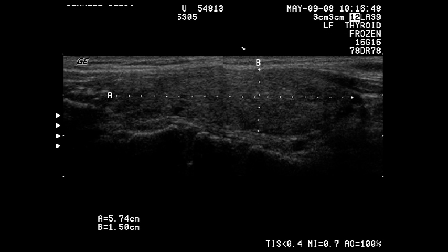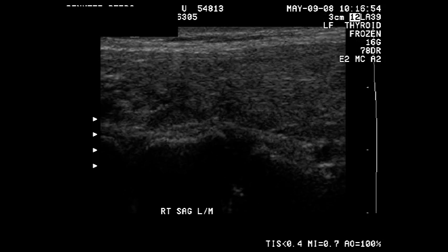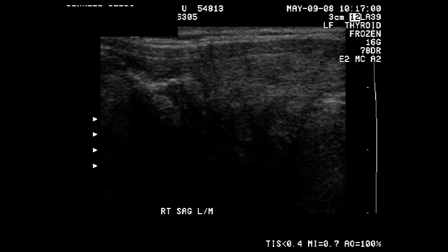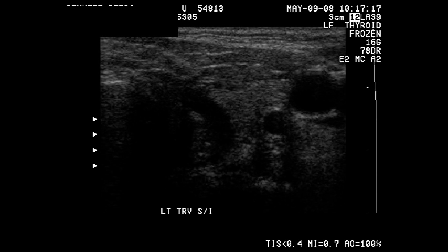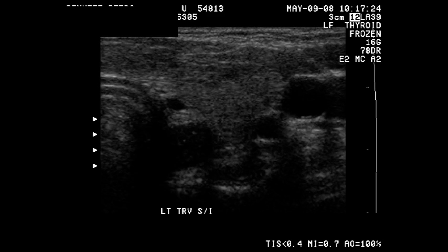Here in these images, the ultrasonographer has moved her probe to give us a sagittal image, and she's labeled it accordingly — it says right sagittal. It's important to understand the orientation of the probe so that you can eventually understand the photos.